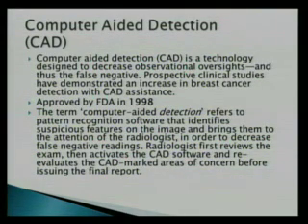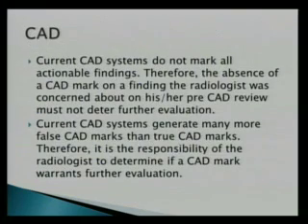Just a little bit about computer-aided detection. We use it on every one of our images, but it was approved back in 1998. And I like to mention it to the residents that I don't use it as my primary tool. I use it if I'm looking at my image and I'm worried about something, and I want to just see what CAD thought about it. And if it marks it, it gives you a little bit more certainty that, I should call that back. If it doesn't mark it, it doesn't help me in any way because I'm still going to call it back if I'm worried. So that's the issue with CAD.